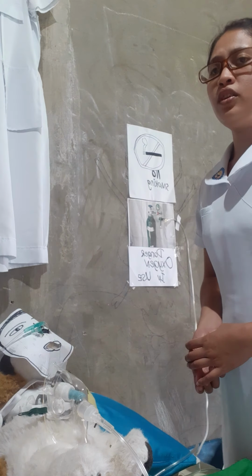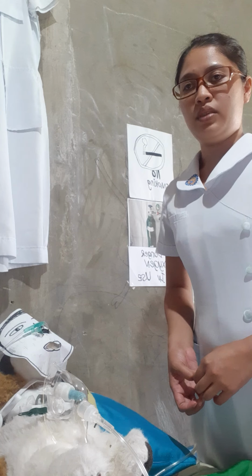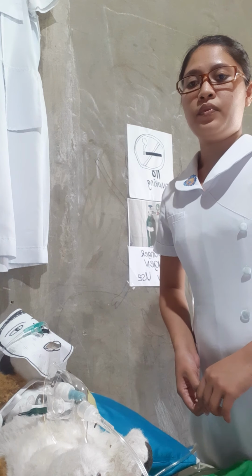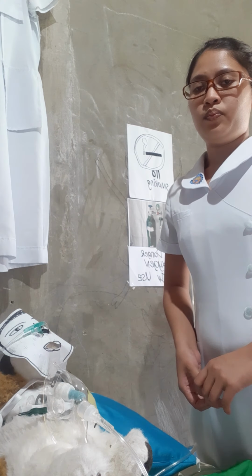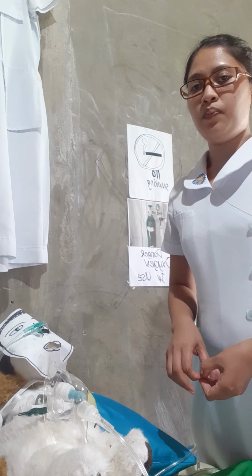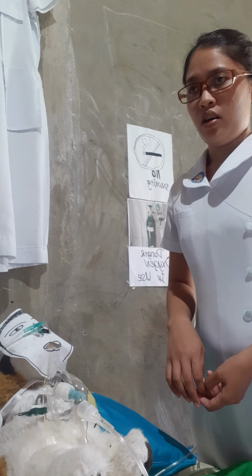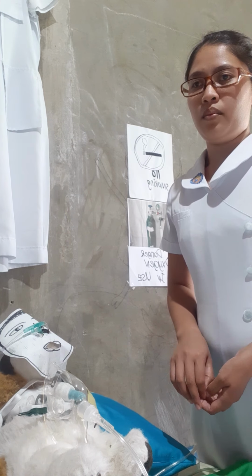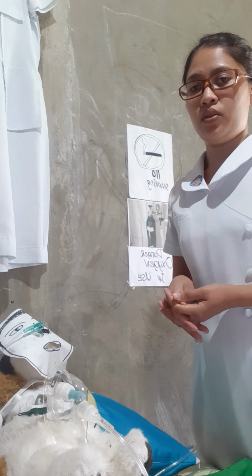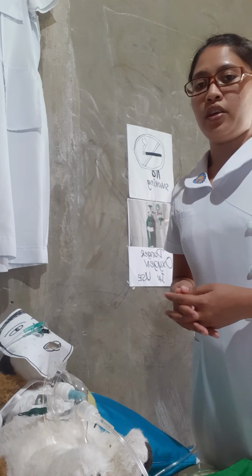Next, we need to determine the need for tracheostomy care. Assess the patient's pain, and we need to administer the medication if needed. Afterwards, we need to explain the procedure to the patient, what we are going to do and why we are doing it. Even if he appears not to be alert, we need to reassure that he or she can interrupt us during the procedure, even if he or she encounters respiratory difficulties.